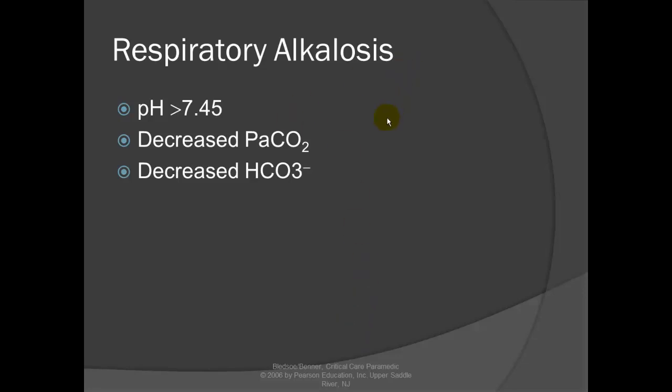Respiratory alkalosis. This person just broke up with their significant other, and they're anxious and breathing really fast. Whenever you get the first ABG, the pH is 7.56. The PaCO2 is 17. HCO3, since there's not enough CO2 to make it, is 15.